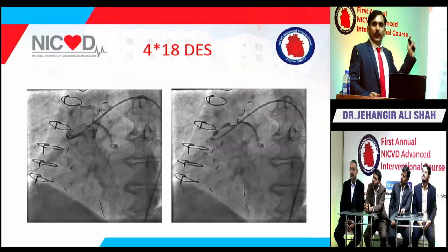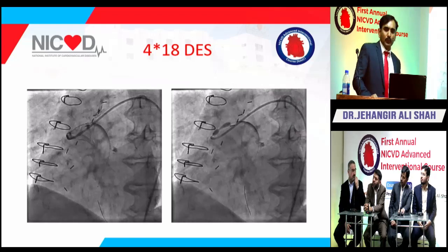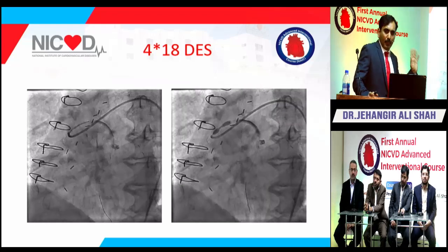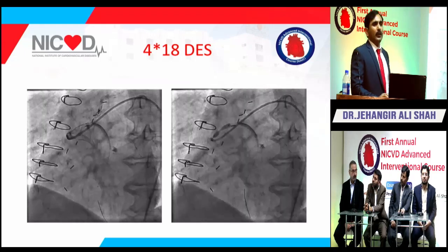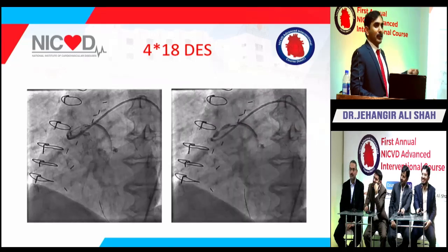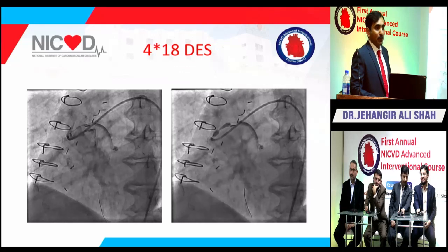So I have taken multiple views, but did not show the scene in multiple views. This was the best view to see. If you are discussing whether I missed the ostium or not, it totally depends on that. Sorry, I don't know exactly how much the stent is protruding, but the literature shows you have to place your stent 1 to 2 millimeters inside the aorta to cover the ostium.